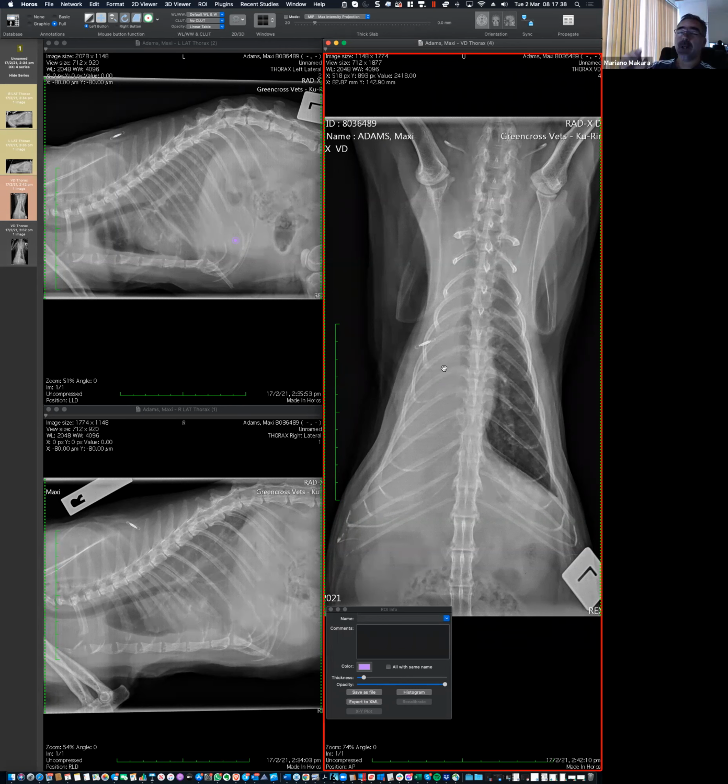So let me rephrase that. I think it's unlikely to have something producing a primary pleural effusion that is so severe, or a mechanism resulting in complete atelectasis of one hemithorax and no mediastinal shift. If you're going to increase the pressure, what I think is going to be happening is you're going to have a mediastinal shift before you collapse all those lung lobes, the right ones in this case.